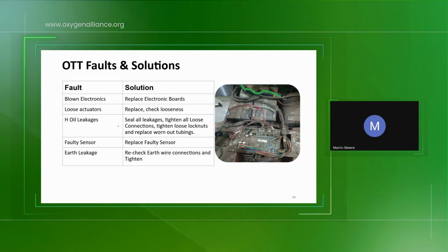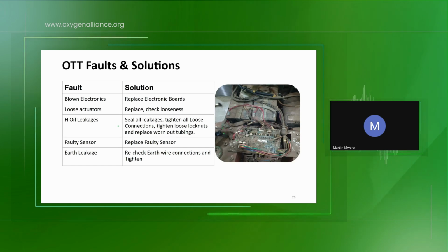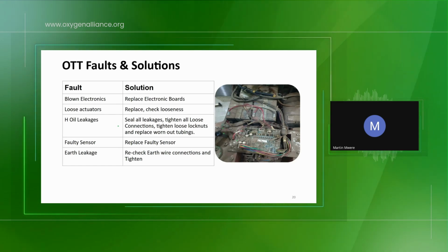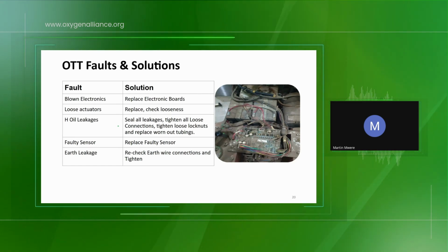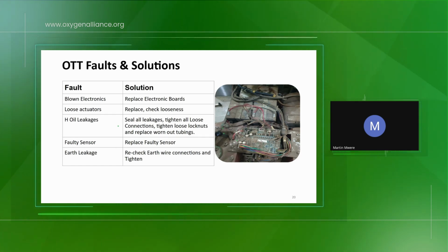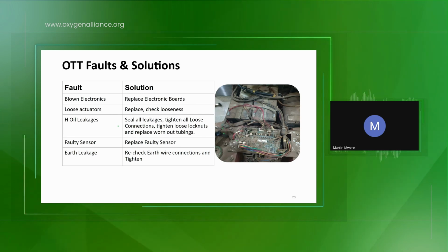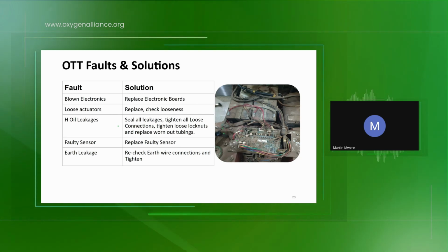We have a faulty sensor. The tubings are here. These are the batteries. These are the tubings also. These are the electrical wires. These are the electronics. This is the inside part of the chair. If the sensor cannot be tilted at the angle you want, it means that sensor is faulty.